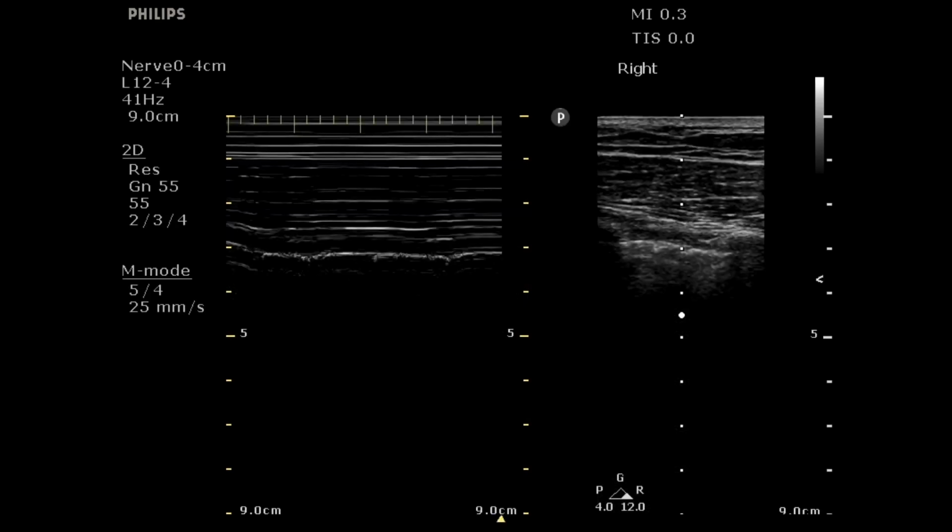So we'll look at the right side. Again, we see the rib and pleural line on the right-hand side of this image, and the M-mode caliper showing us the tracing on the left, and we see that striation in the anterior fields. You can see that granulation in the deep fields, suggesting that there is normal lung sliding at this rib space. So from a large size pneumo tension physiology, not likely, at least on the left and the right. I think I can keep looking and seeing what's going on with this patient. And again, I can circle back either with my ultrasound or other forms of imaging to rule out a small pneumothorax, as we get further into this patient's care, right?